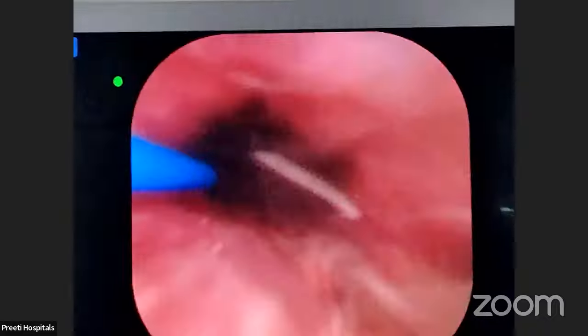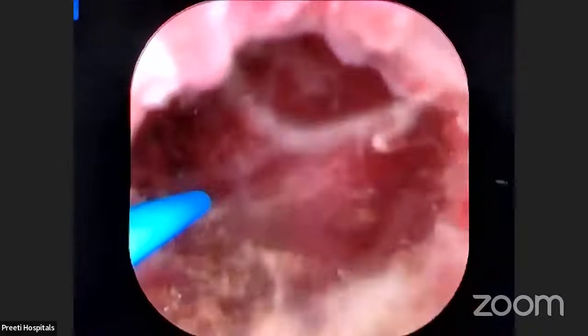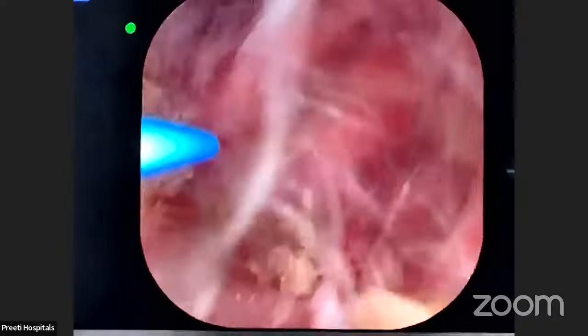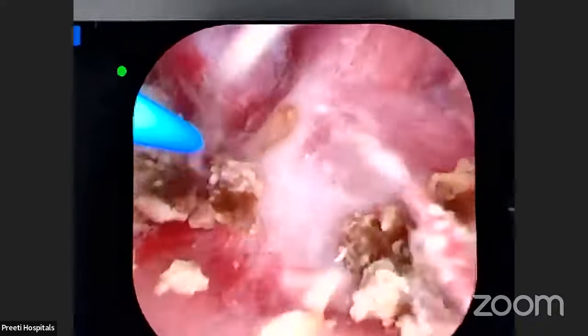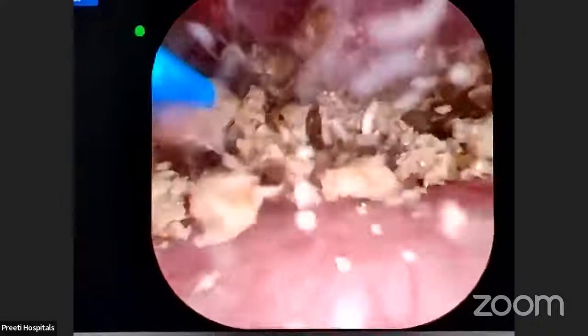See, I have the best assistant here, best team, the senior urologist, who is sucking out all the powder. Okay? Now see, volume is reducing fast. So I will go here. Keep on doing that. Don't flush. He is not flushing now. Ramakrishna is not flushing now and he is just keeping the stones in the calyx. Now at this stage, these are dynamics. You don't flush, you don't create unnecessary turbulence, and keep everything in the center.